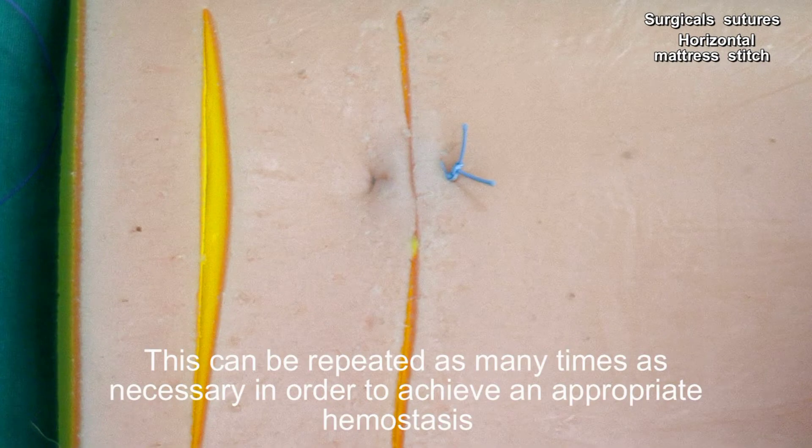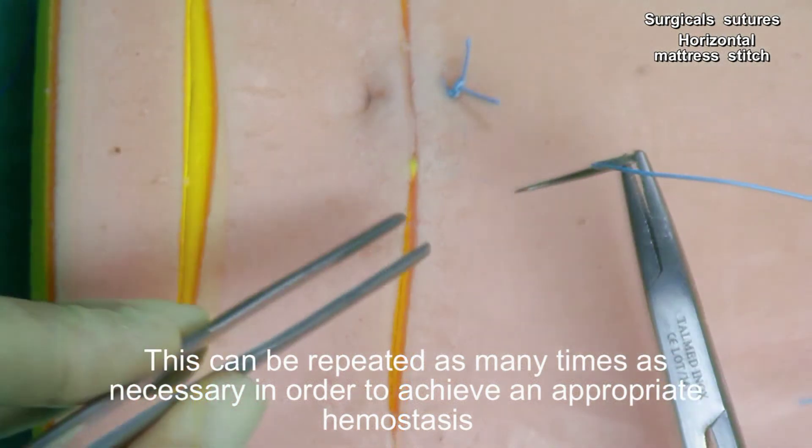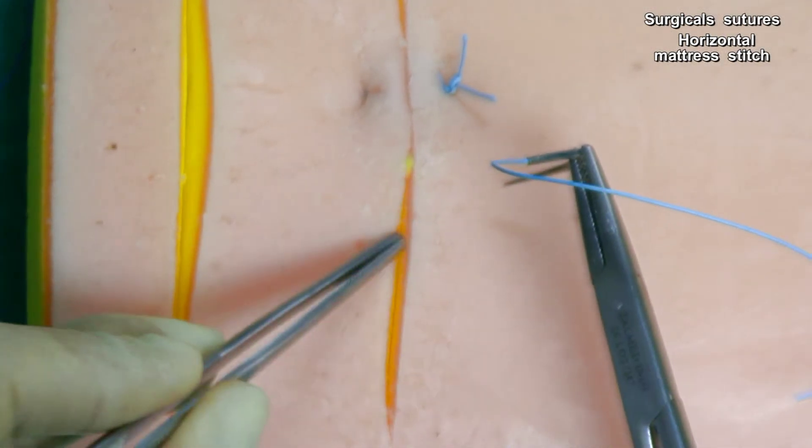This can be repeated as many times as necessary in order to achieve appropriate hemostasis.